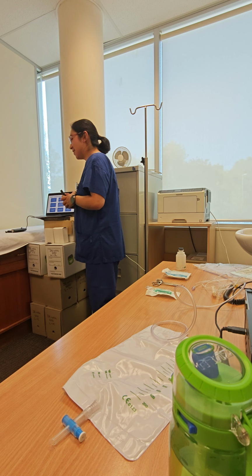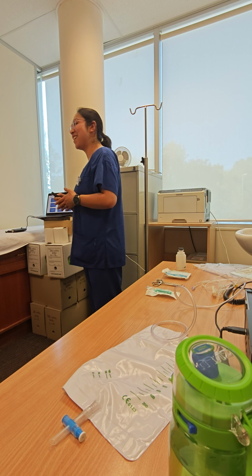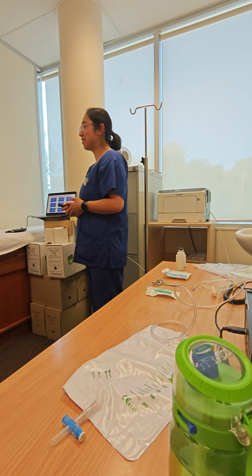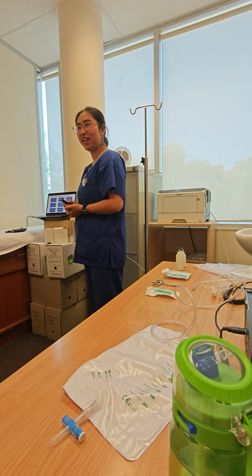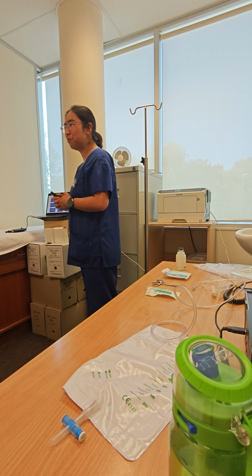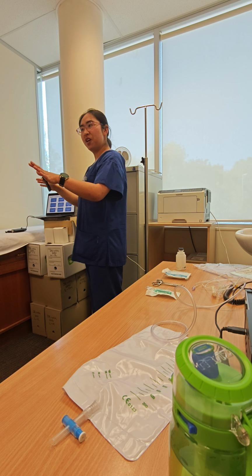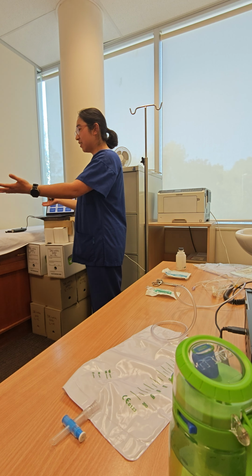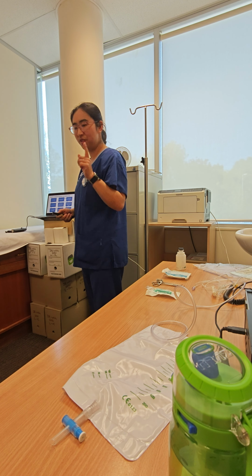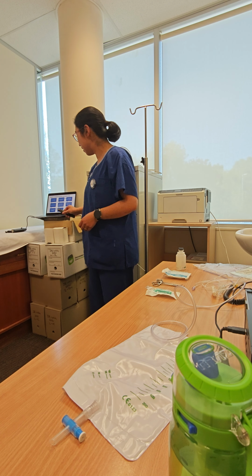Okay, now let's start. When we start one day of work, we come into the workplace, open it up, and we see a cystogram there. So what are we going to do? The first step, we go into the screening room and start the setup. We turn on the machine to make sure everything is working. It's a nice and tidy workplace. Very well. Now we're going to start setting up our workstation for our tools and equipment.